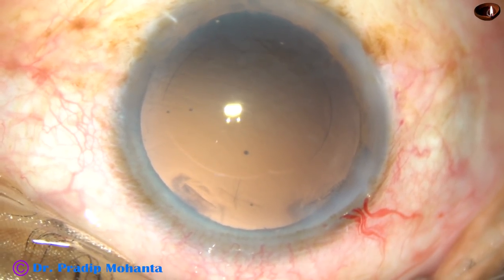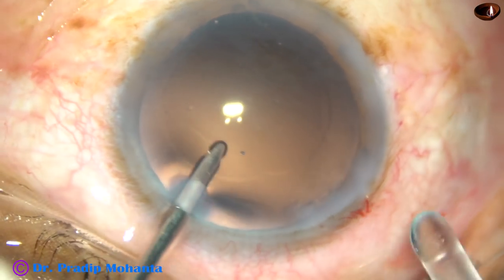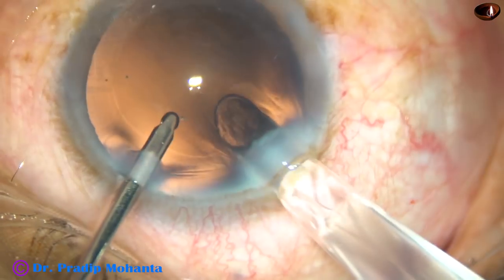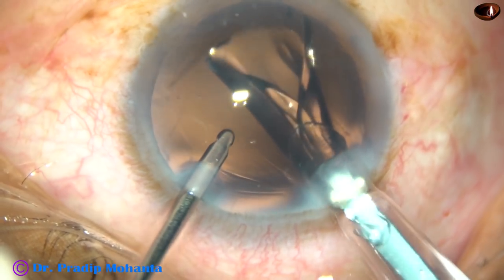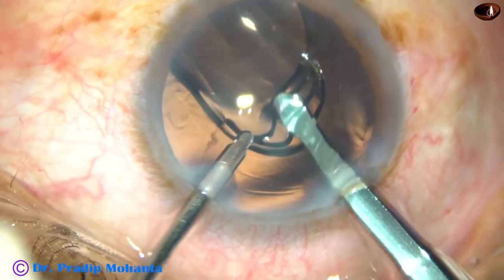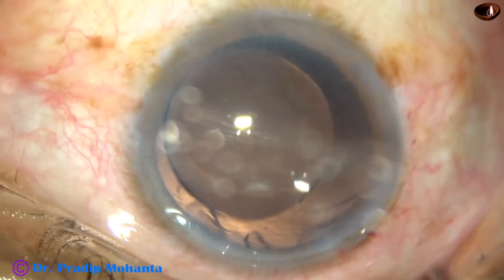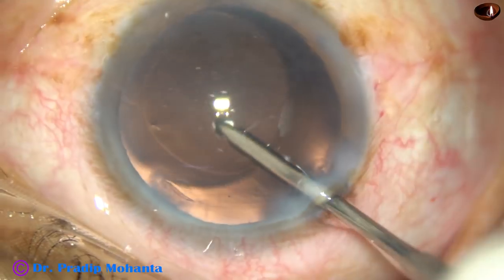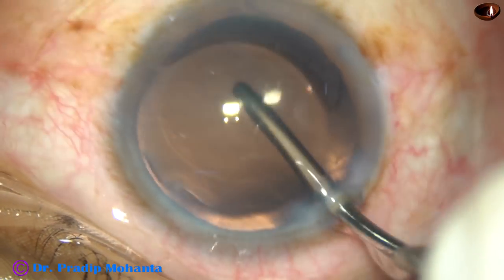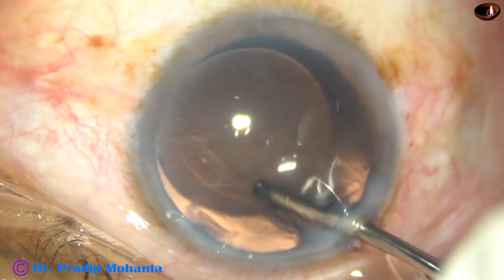And now it's time to implant an intraocular lens. This is hydro-implantation — just by a push of the irrigating probe, the trailing haptic goes into the capsular bag. And most of the time, you don't have to use a Sinskey hook.